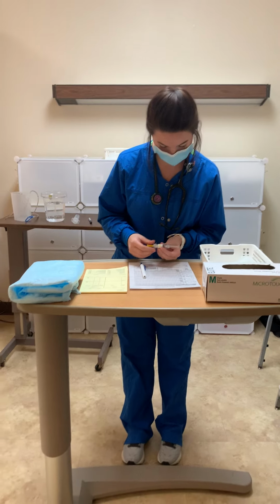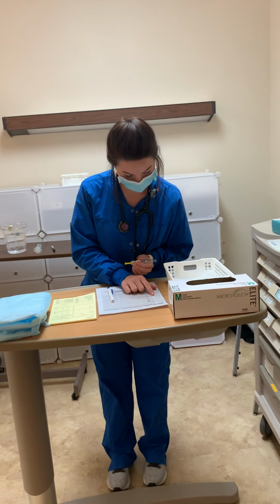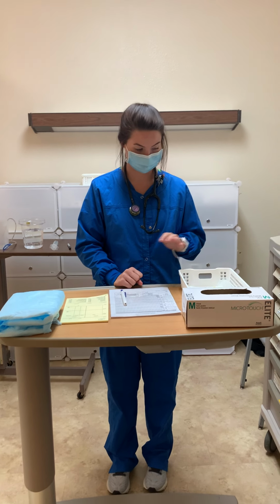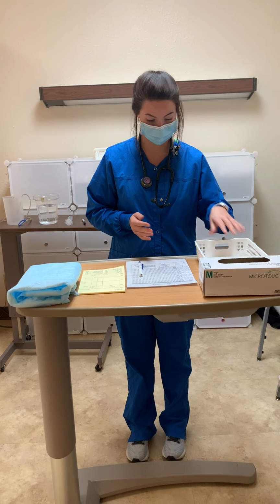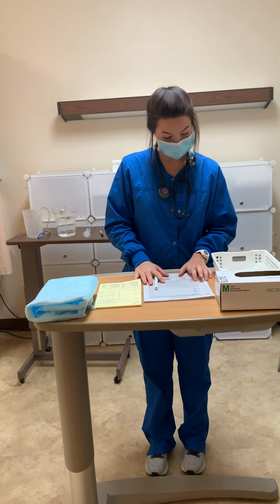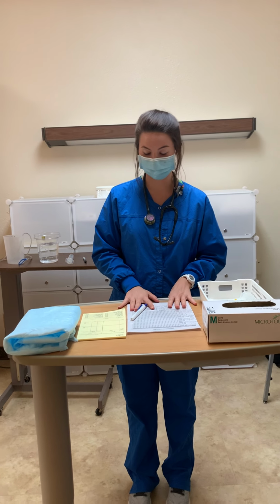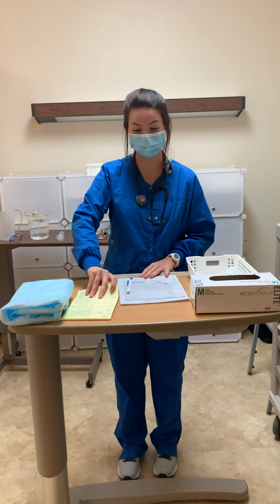So just making sure that I have the correct medication, checking my Lovenox 40 milligrams, and then that looks good. So I'm just going to put that into my basket, and then my Jevity, which I'll have here, 40 milliliters an hour, and these are both given at 8 a.m. So that was my first check. And then I'll also just describe how to do intake and output as well.